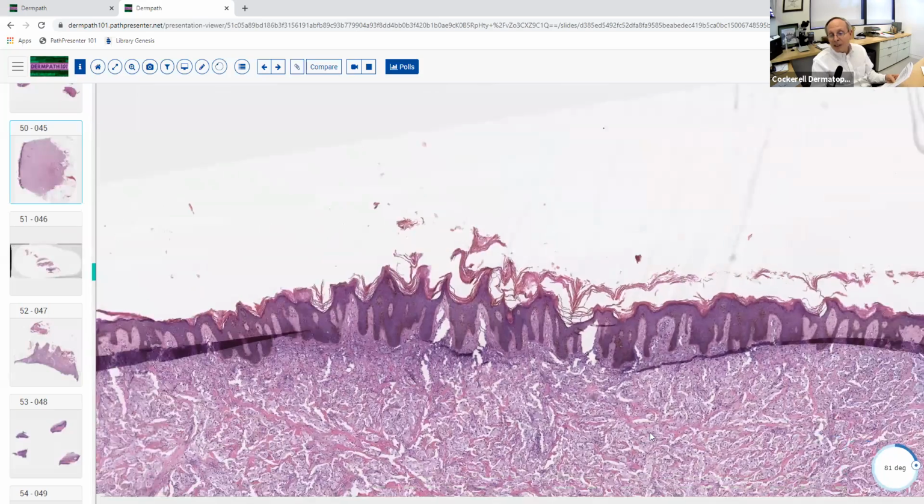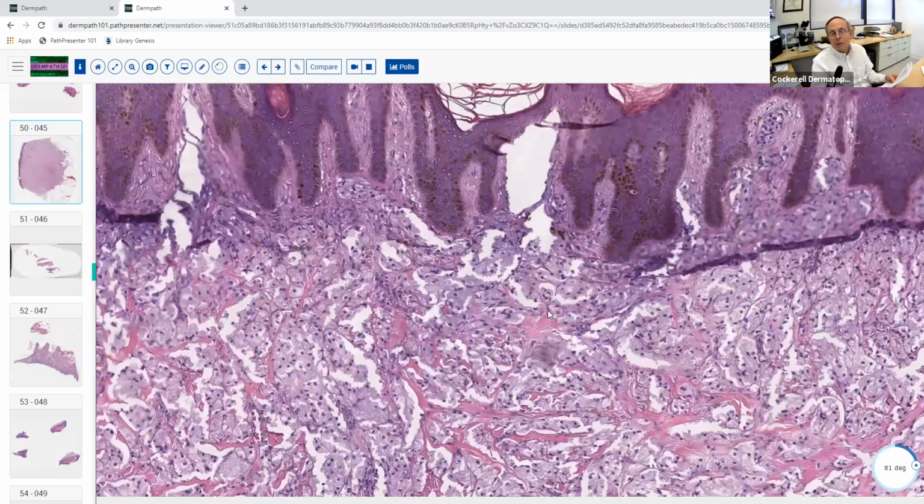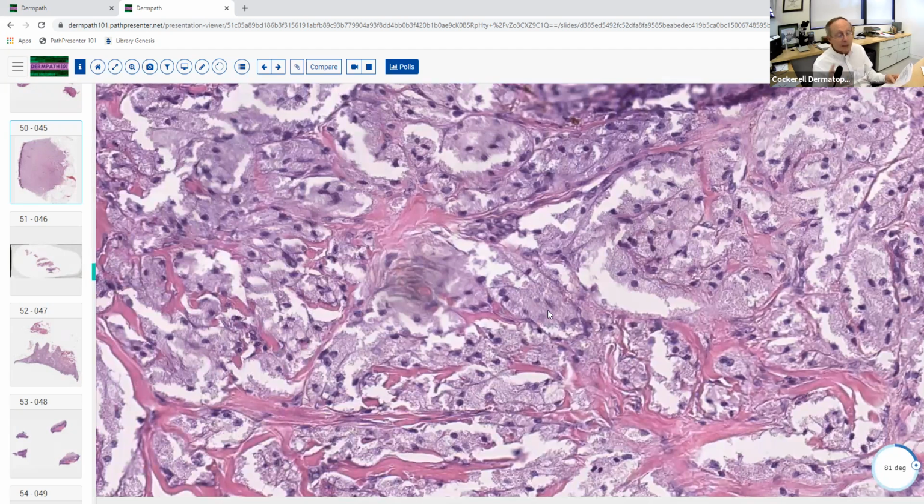Those get a lot more vascularity. There's more atypicality, there are mitotic figures, and those have clear cells, not granular cells. And it's clearly not an atypical fibroxanthoma, although there is a variant of AFX that can have a granular cell morphology to it. They probably wouldn't put that on the exam, but the classic AFX is a spindle cell tumor and really wouldn't simulate this. And even if it was a granular cell variant of that, it would have more atypicality and mitotic figures, and not these very small uniform nuclei that we see here. So that's granular cell tumor. Just remember the etiology of that entity.